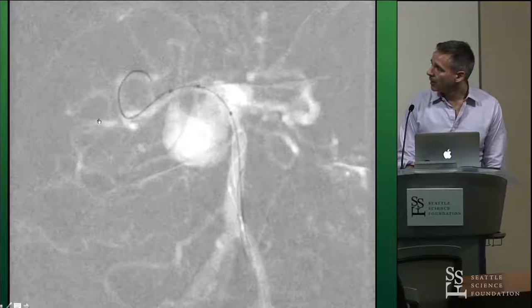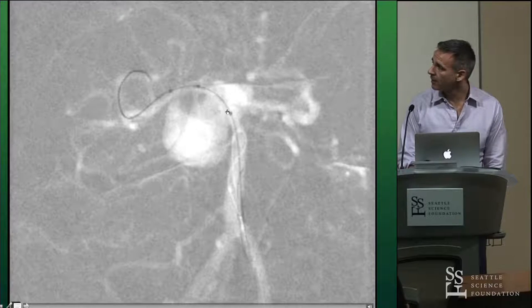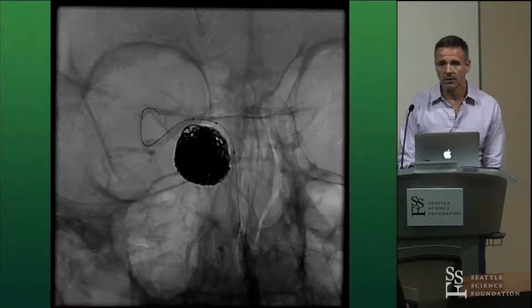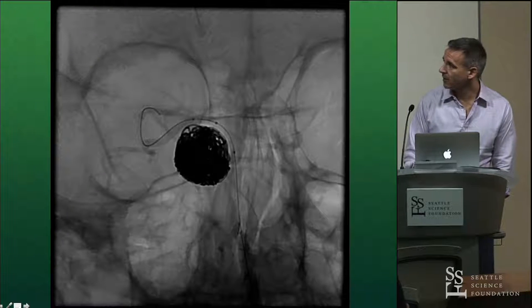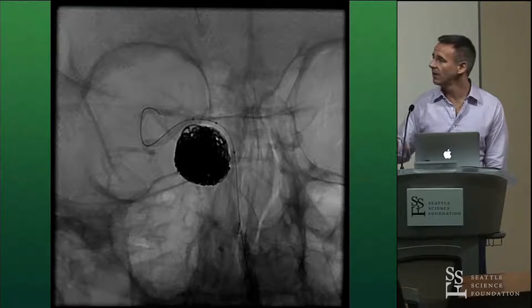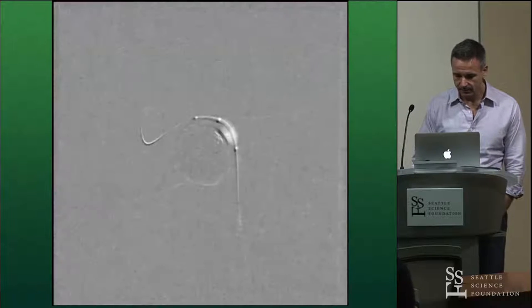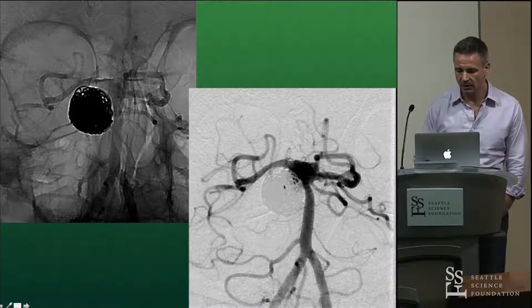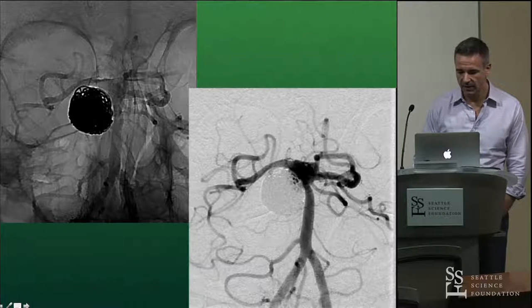So I put just a 4 by 11 Scepter XC across the aneurysmal segment and inflated it as much as I could and just filled up the aneurysm with coils, knowing that we would deconstruct that SCA and that it was going to be occluded. Even with the balloon inflated maximally, there were coils herniating around the outside of it, going up into the basilar apex portion — demonstrating to me that the aneurysm actually incorporated the entire basilar and the basilar apex. With the balloon remodeling technique, we were able to get this coiling done. We had to deconstruct the entire right SCA — there's the coil ball in the SCA.